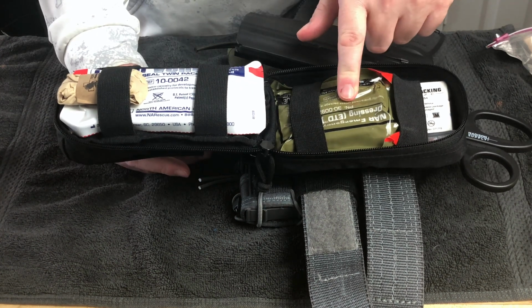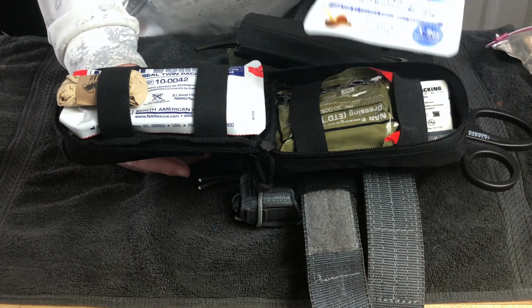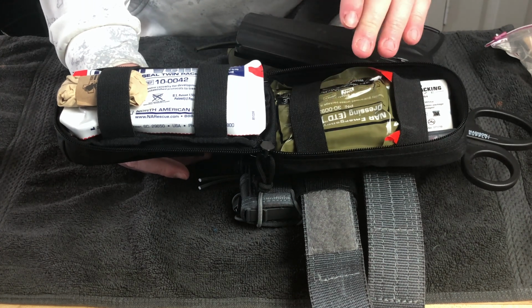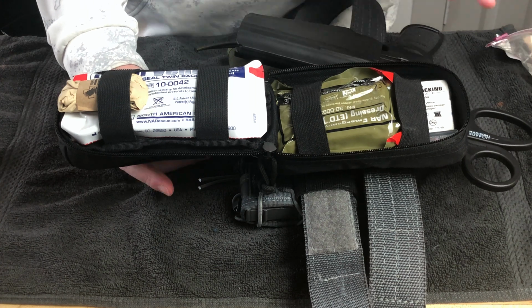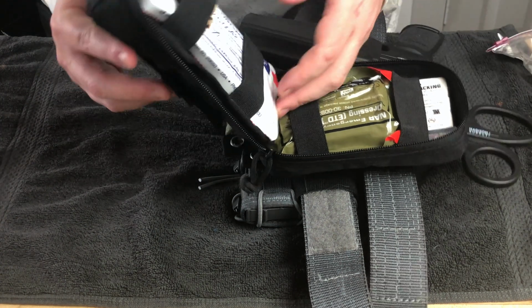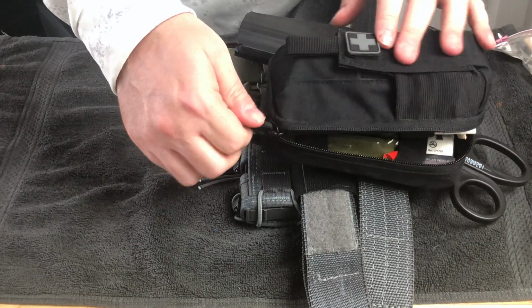I do want to replace this with a quick clot version. It's on my list. When I got it, I thought that I had a quick clot pressure bandage, and it turned out I didn't. This is the kind of kit you put on your belt. You know, that's exactly what it is. It's a kit to go in your belt.